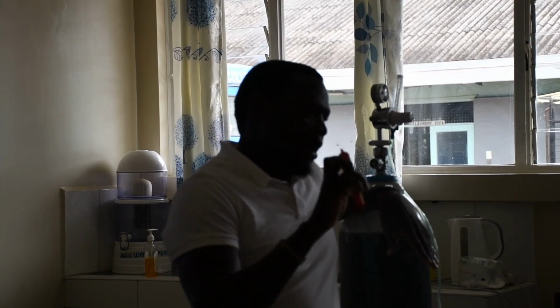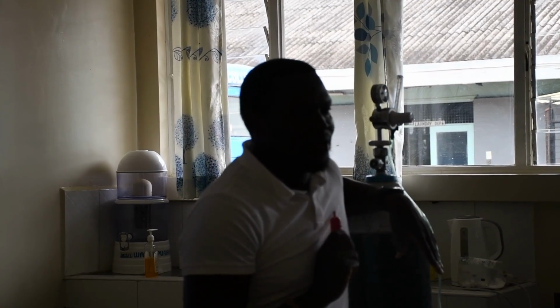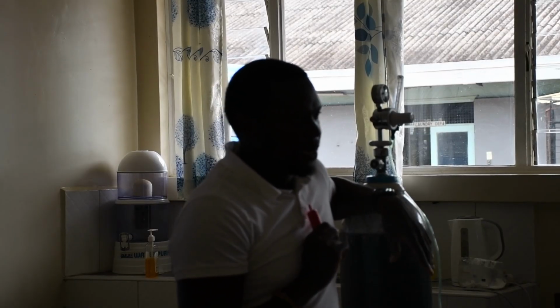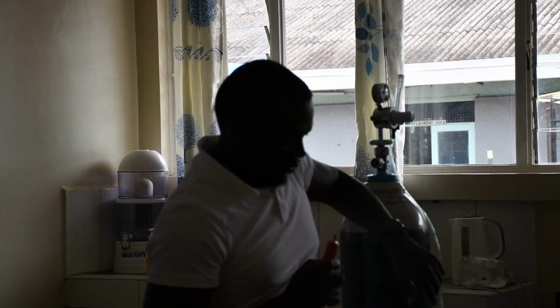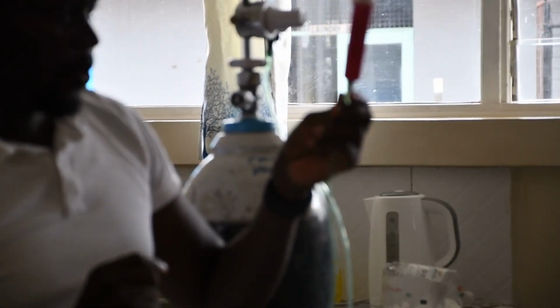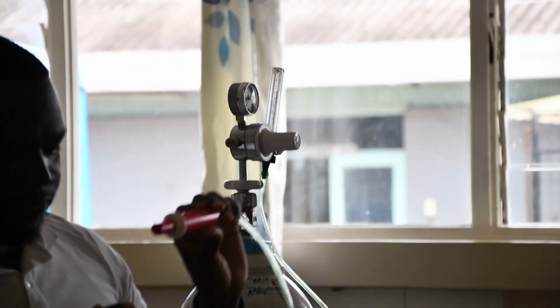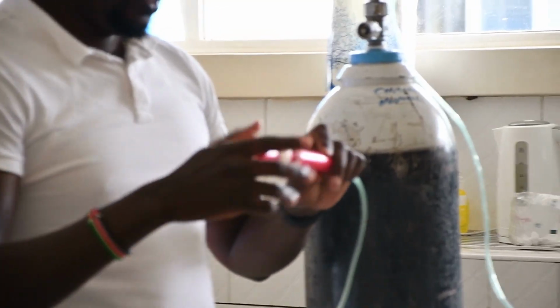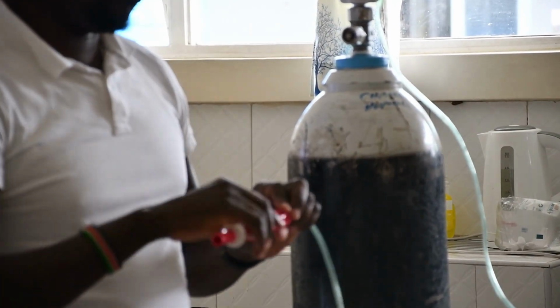Okay. Up to the blender system, are we clear on how it works and what needs to be done? Okay. So now this nozzle comes through, and it should be tight as well. Okay. So this is what you have. So imagine this. Let's say you start at whatever, 30, 50 or whatever.